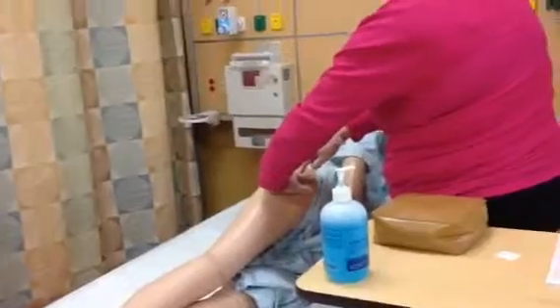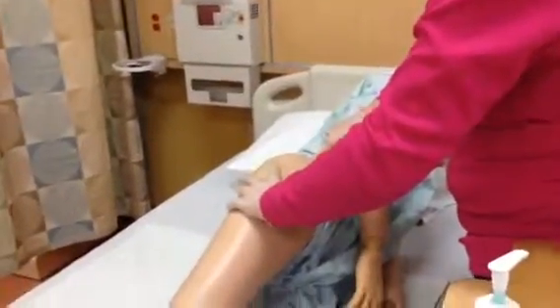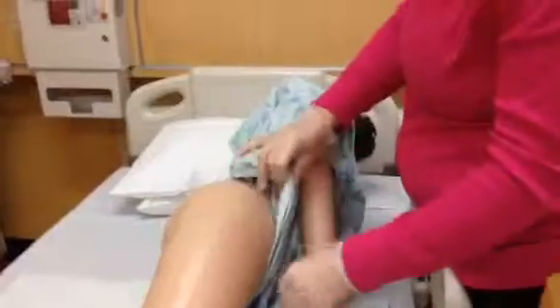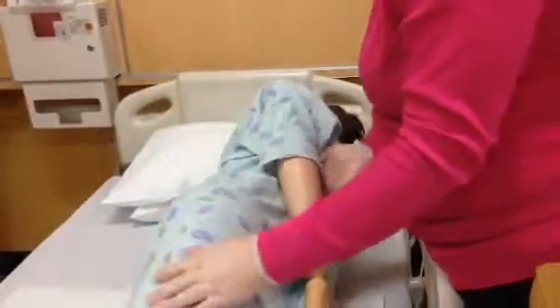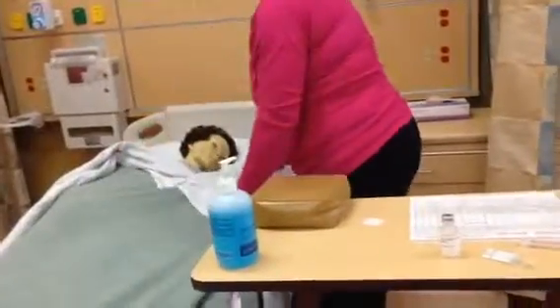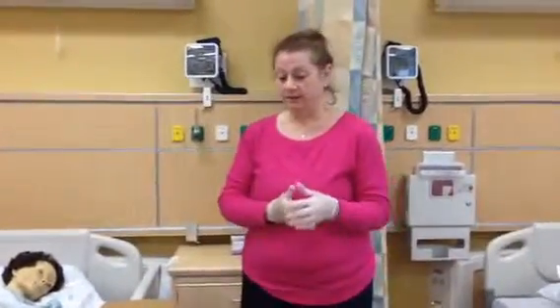I could leave the alcohol swab right there to mark my site. I would Z-track, getting my hands out of the way, and then I would inject the medication right there. I would not massage nor do anything with that. I would put a Band-Aid if necessary, put my patient back on her, whatever her comfortable position is, cover her back up, put the side rails back up, raise her head into a comfortable position, ask if she needs anything, and then I would leave the room.